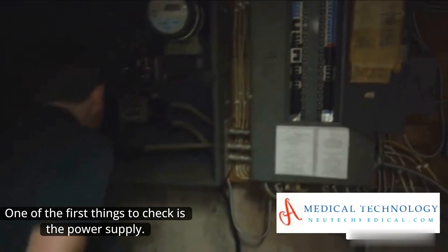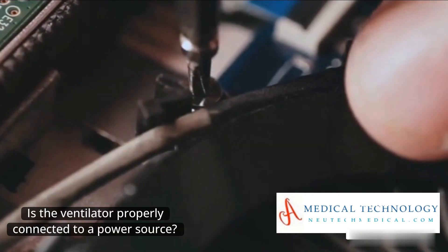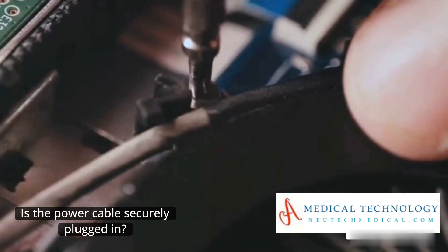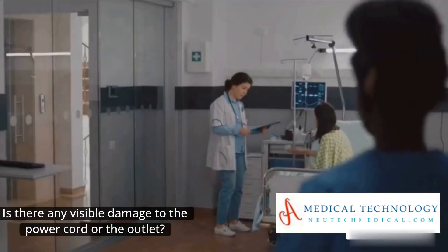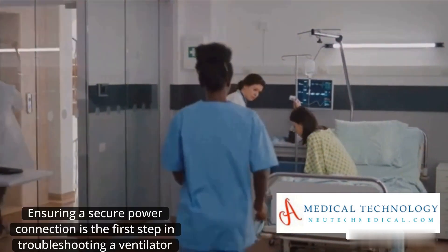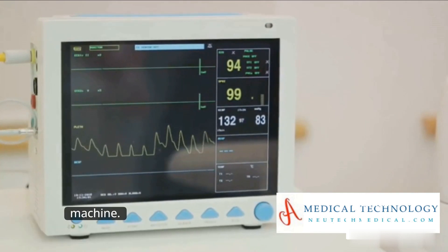One of the first things to check is the power supply. Is the ventilator properly connected to a power source? Is the power cable securely plugged in? Is there any visible damage to the power cord or the outlet? Ensuring a secure power connection is the first step in troubleshooting a ventilator machine.